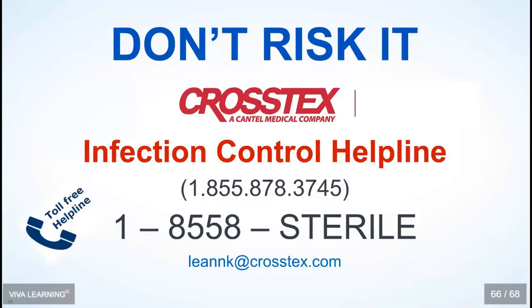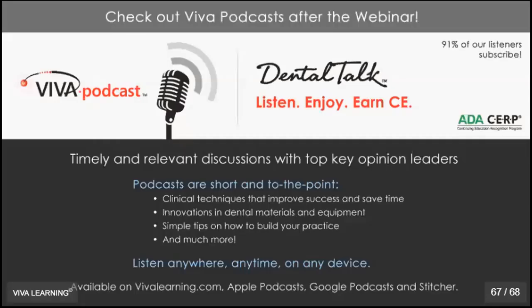And so with that, I'm going to open up to questions and answers. The question came in from Ashley: how often should you replace a filter? There's a number of different filters in each type of sterilizer. So in your manual, there will be a guideline in the back that gives you those recommendations on how to evaluate it and how often to replace it. I can't give you a definitive answer because it's dependent on each sterilizer manufacturer. If you can't find the original book that came with the box when you opened the sterilizer, I've been able to go online to each of the main sterilizer manufacturers and download the manual directly from the internet, so it makes it easier to get it.